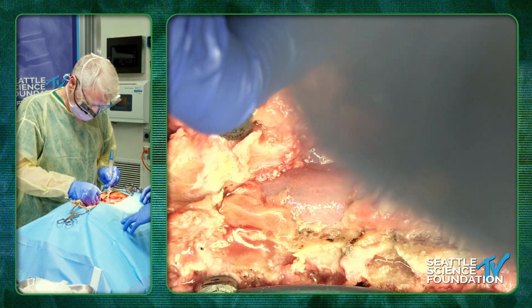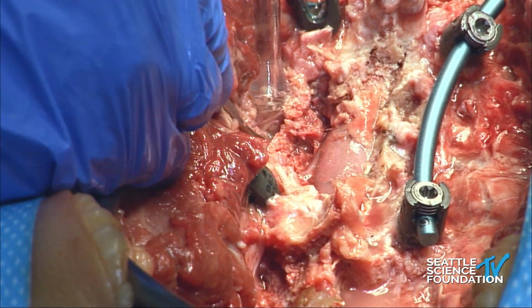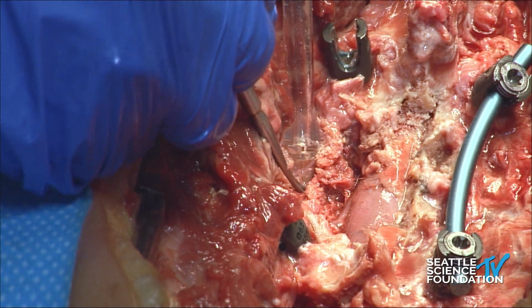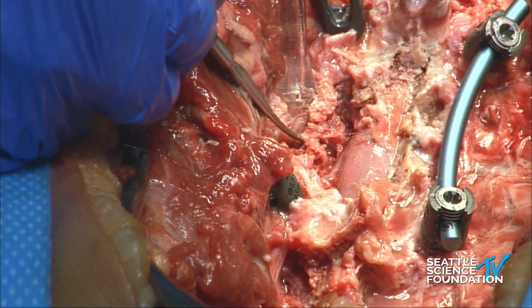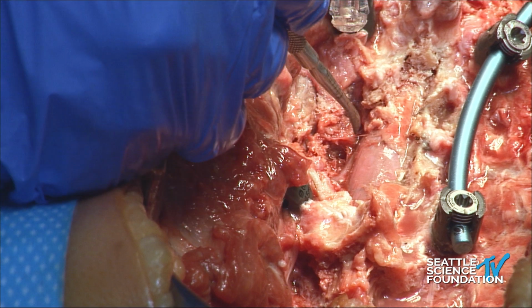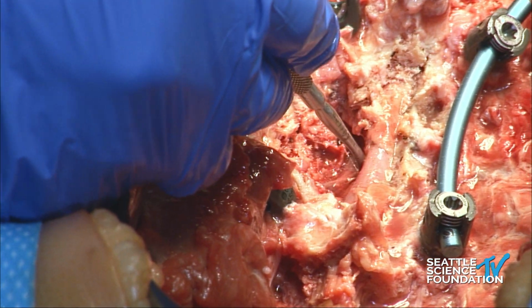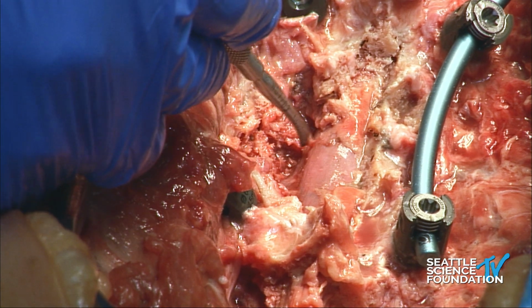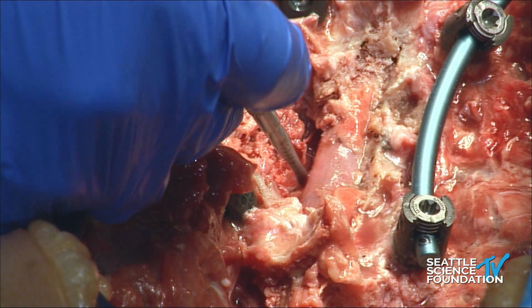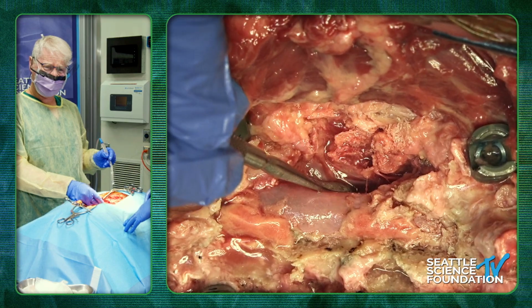And the next thing I like to do is basically just slide down the pedicle a little bit, and you can get quite anterior here. And if you stay on the pedicle, you stay away from the vessels. And then on the other side, there's usually a nice venous plexus that runs, I don't know if you guys can see it, just medial to the pedicle here. So we'll spend some time. You can see the nice vein here. Does it show up? Yes, we see it quite nicely.